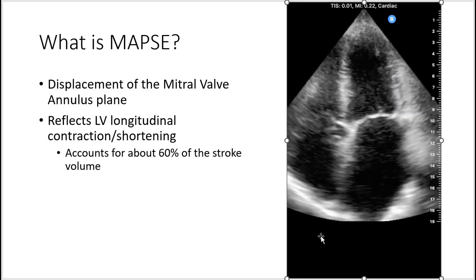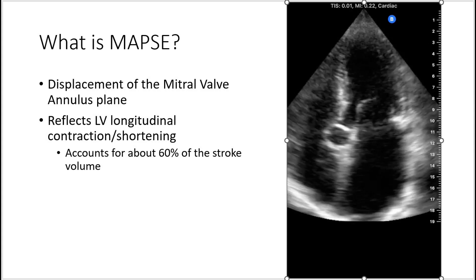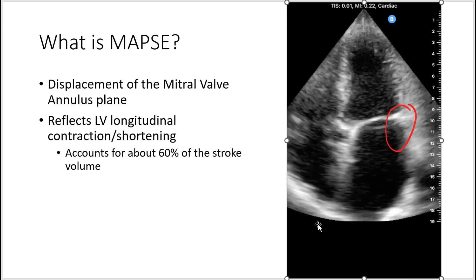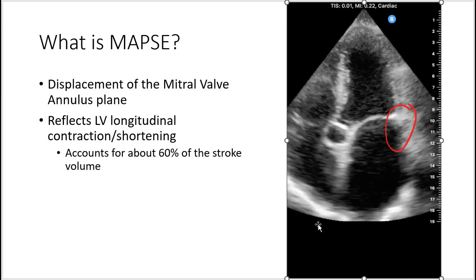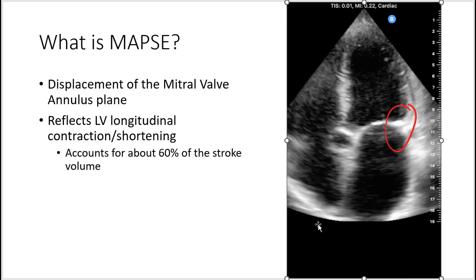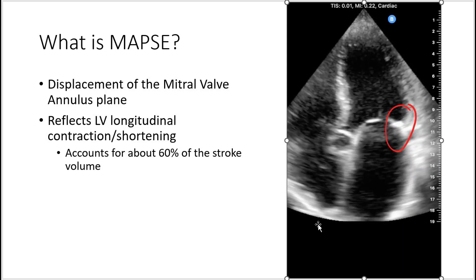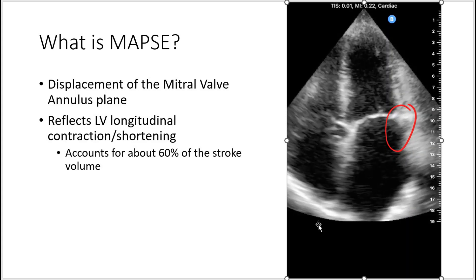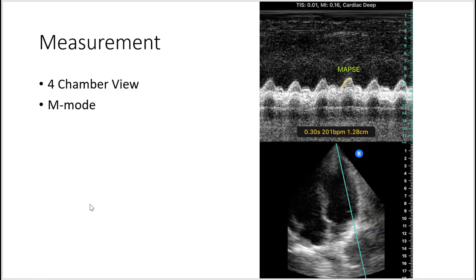Let me bring your attention to this area — that's where the mitral valve annulus is. As the heart contracts, you can see that this area moves up and down, and that is the displacement of the mitral valve annulus plane. Measuring that displacement will allow us to assess the LV function.